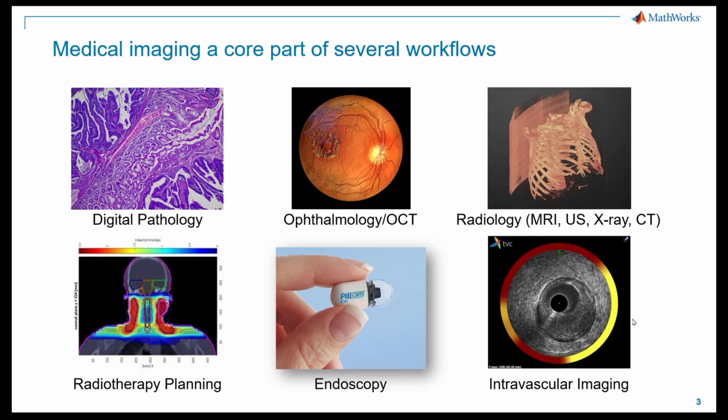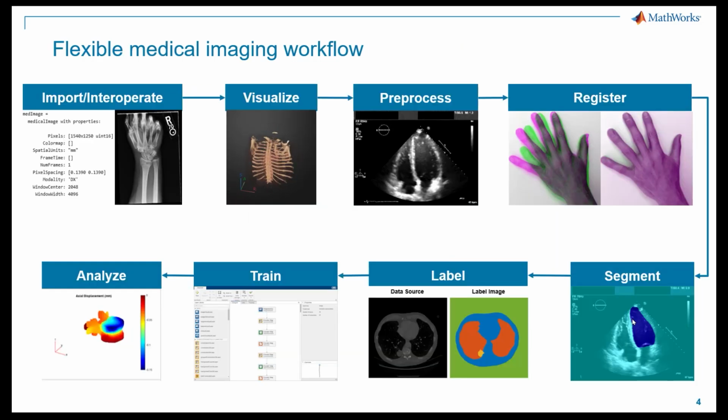Well, we have people who work with MATLAB all over the board. Things like digital pathology, endoscopy, radiation therapy planning, optical coherence tomography and ophthalmology, irradiation, radiology, all kinds. Regardless of what you're doing and what you're focusing on with our tools, you typically have a standard medical imaging workflow in which you first want to import your data.